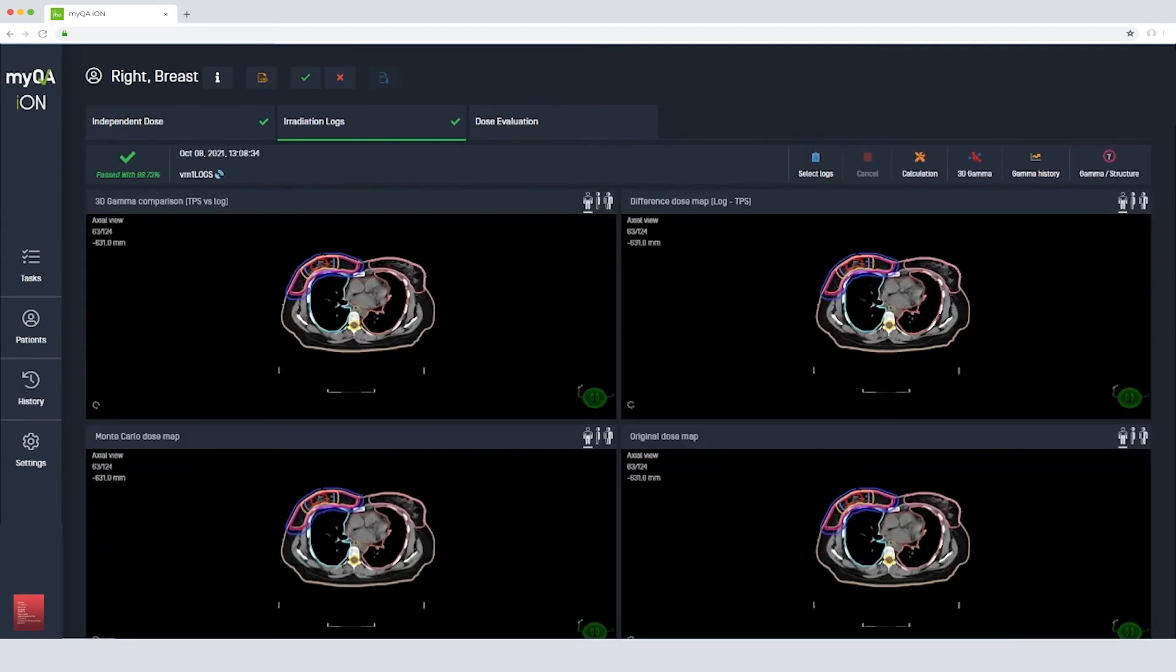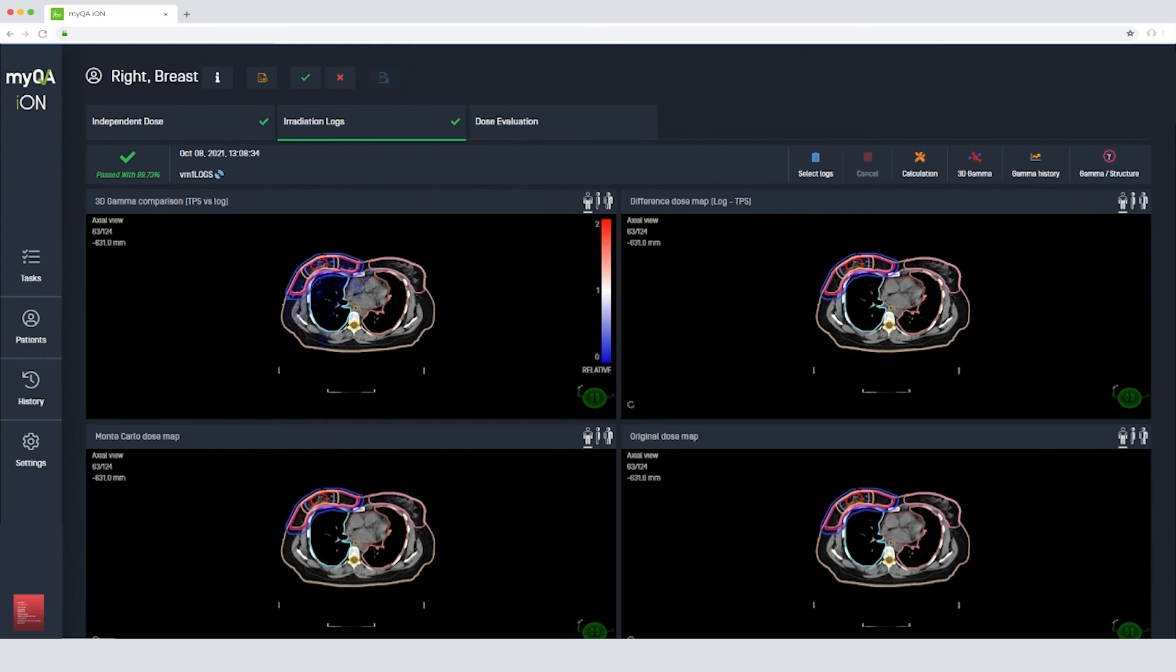Again, we can see the planned dose, the delivered dose calculated from the log files, the dose differences, and the 3D gamma index.